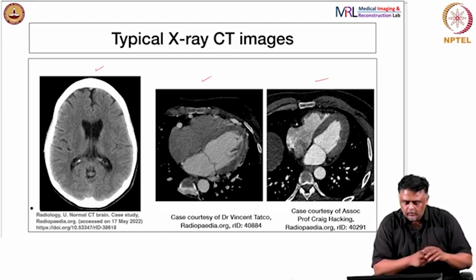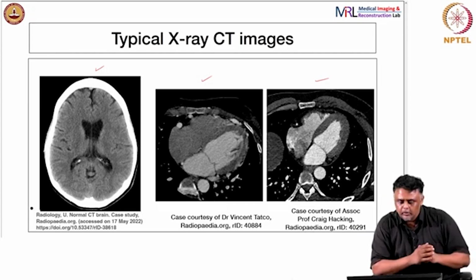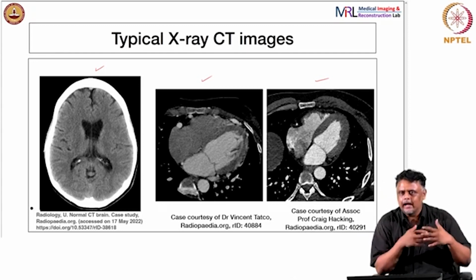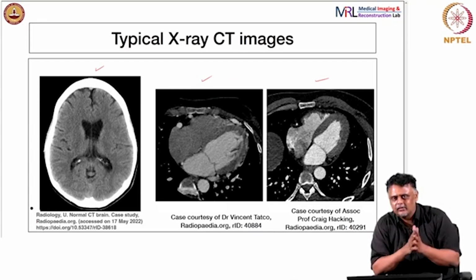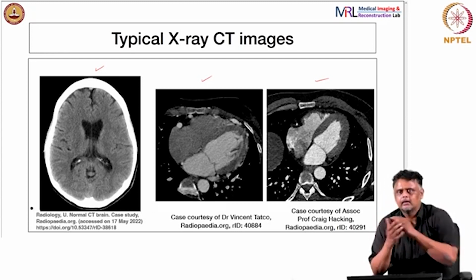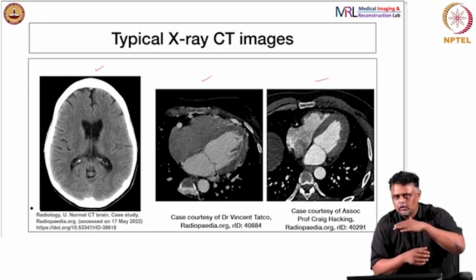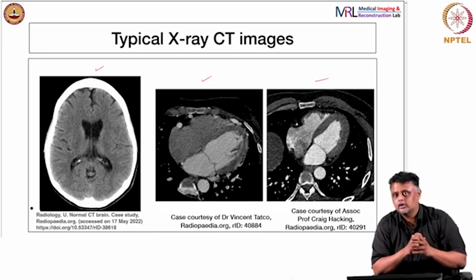This concludes our description of X-ray radiography as well as X-ray computed tomography. The idea was to give you an idea of what is involved in the image acquisition, what exactly we are imaging, and what the images represent. For a projection radiograph, we saw a superposition of anatomies, because we are summing the attenuation coefficients through the body. CT images are cross-sectional maps of the X-ray attenuation coefficient obtained from a reconstruction algorithm. We did not go through the algorithm, but gave you a general idea of what is done.